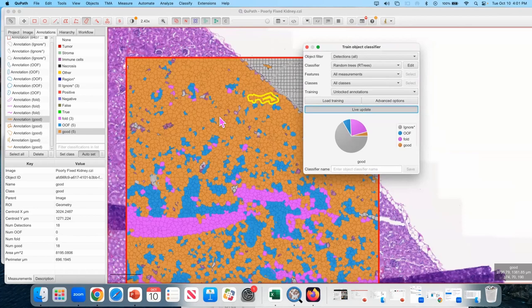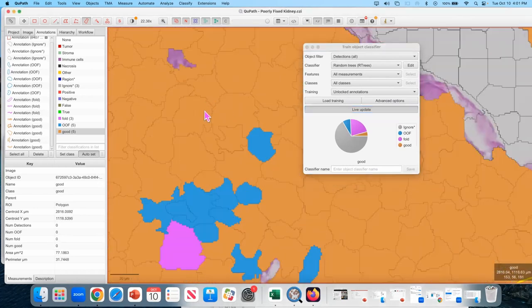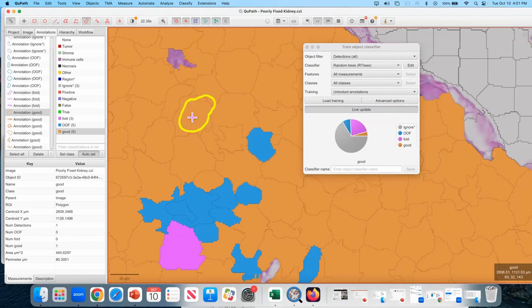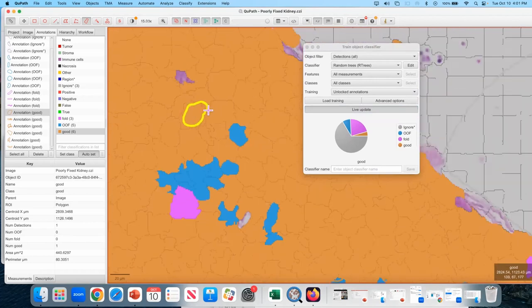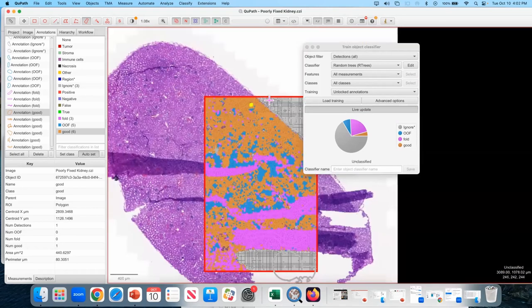Because when I grab this entire area, even though I've highlighted a fairly large area, all it grabbed is one superpixel with one set of features. So it's like one data point. So you're not really at risk of grabbing too much at once, unless you were to select all of this background all at once, one big giant thing, which is exactly what I did. And it's actually a mistake. In fact, I'm going to delete that because it's wrong. Don't do things like what I just did.